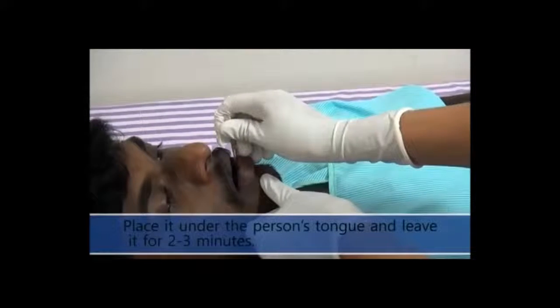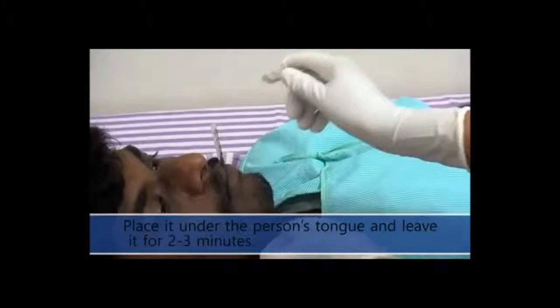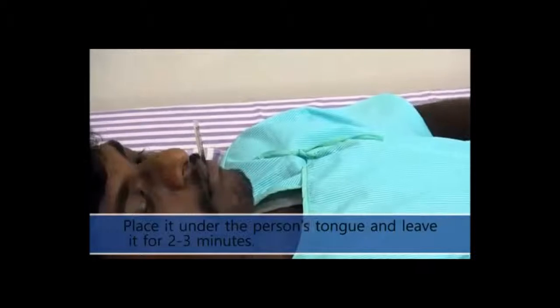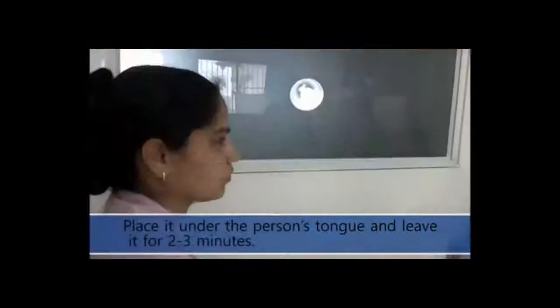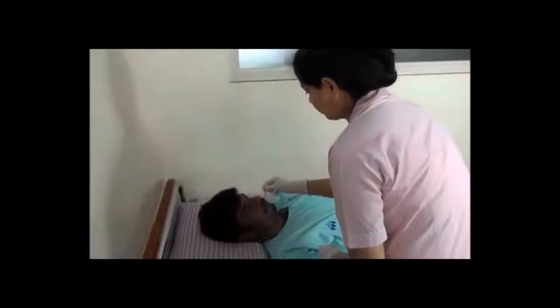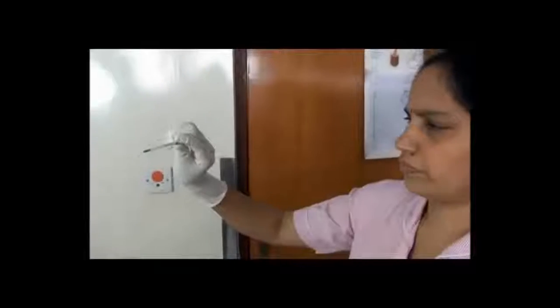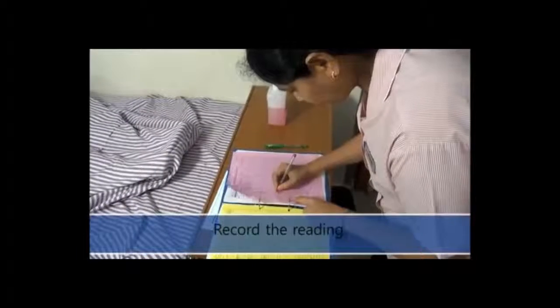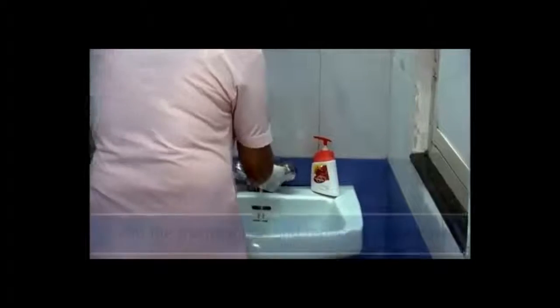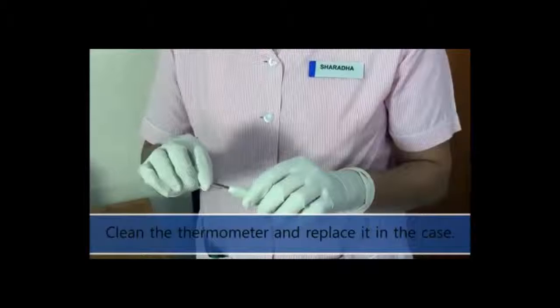Place it under the person's tongue and leave it for 2 or 3 minutes. Record the reading. Clean the thermometer and replace it in the case.